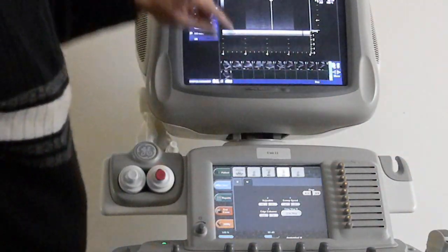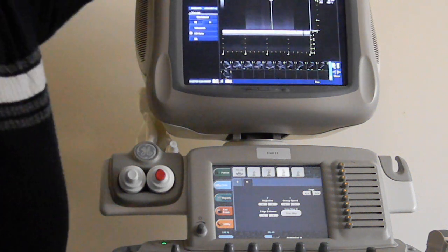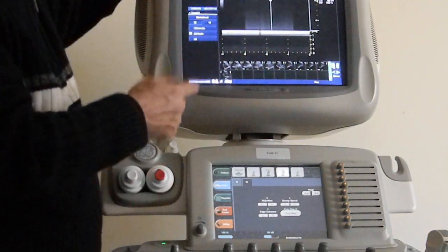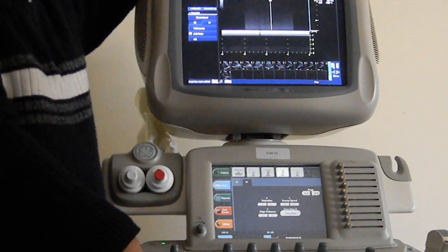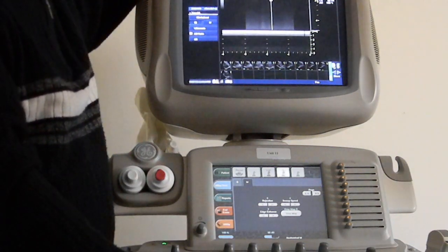And it mainly just uses one pulse to record the motion. There are reasons for that, because had it been multiple pulses, then we would have a poor recording, and there would actually be gaps in this recording down here. But that's again a lot of things that's going to be in physics.